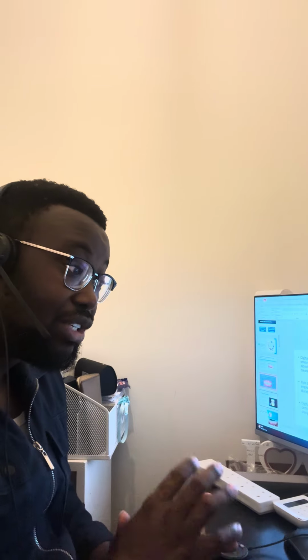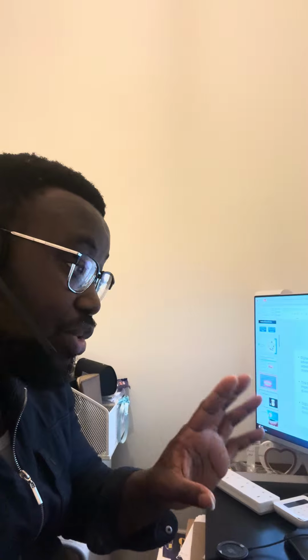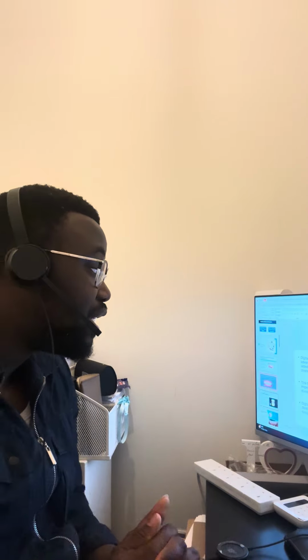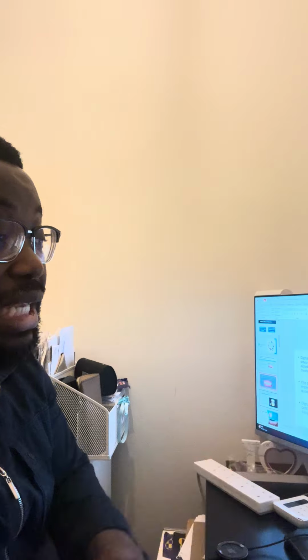and you can see how the software, which you will have in your system, can help you make that visual design with a high level of accuracy and precision. So we say that digital denture fabrication involves the use of advanced computer-aided design and computer-aided manufacturing. So these are the CADs and CAMs.